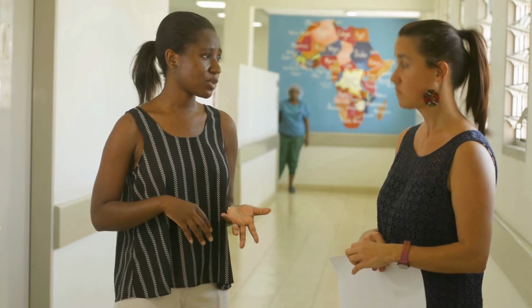I've used it mostly in emergency situations, like I talked about. So mostly in patients that have just come in with a trauma element or penetrating trauma. Sometimes I've used it in adults and pediatric patients, basically to make a decision as to whether the patient needs surgery or not, whether they're hemorrhaging a lot or not. And with the FAST scan, because you're also able to look into the chest area, I've been able to make decisions based on that as well. It's pretty important.